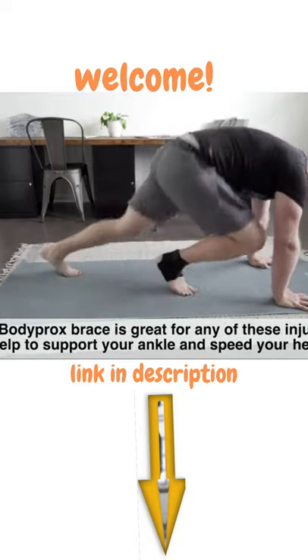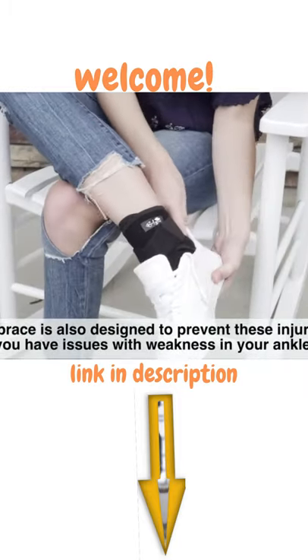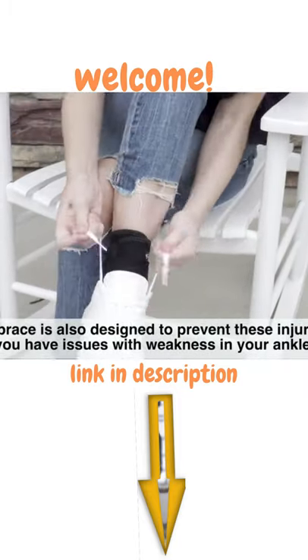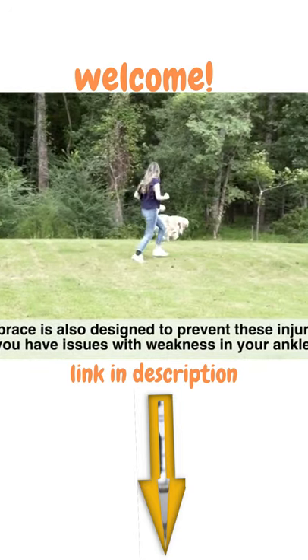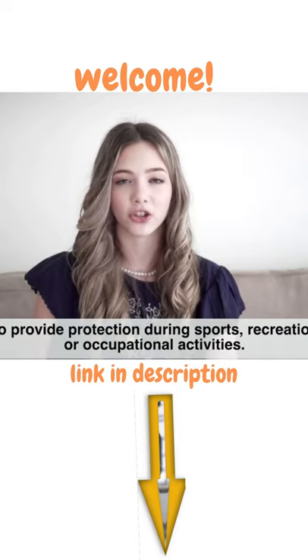The Body Prox brace is great for any of these injuries and can help to support your ankle and speed your healing time. Our brace is also designed to prevent these injuries if you have issues with weakness in your ankle, or to provide protection during sports, recreational, or occupational activities.